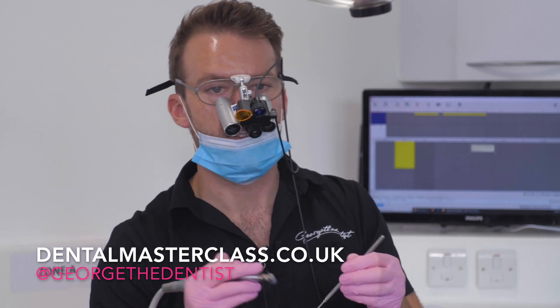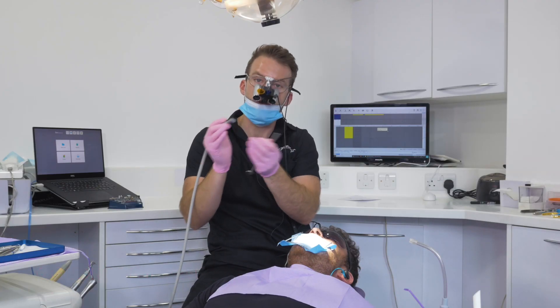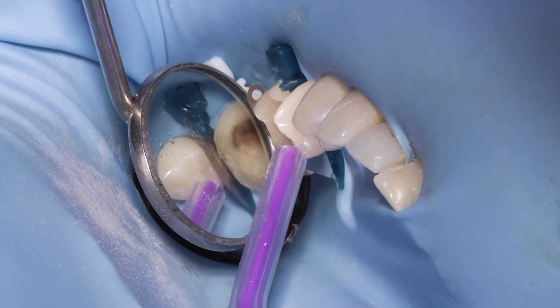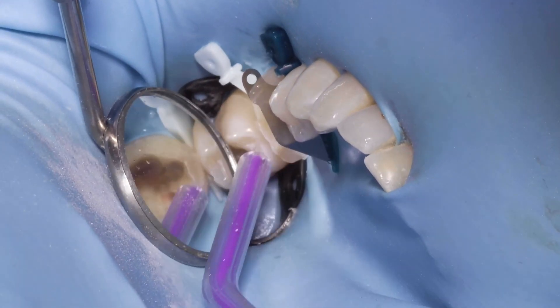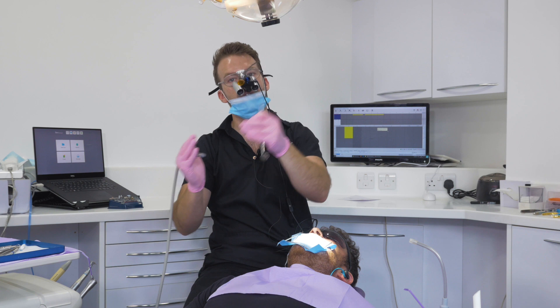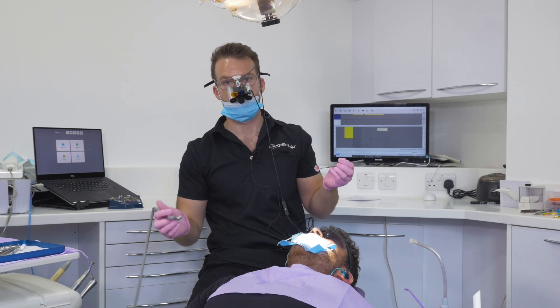It's important to clear the contact point, because often if you don't, when you start preparing through that contact you see that demineralized area of tooth that's so common. So if you make your adhesive restoration above that and then suddenly it starts to get decay underneath it because you haven't cleared that contact, that's a problem because you've got to replace it all.